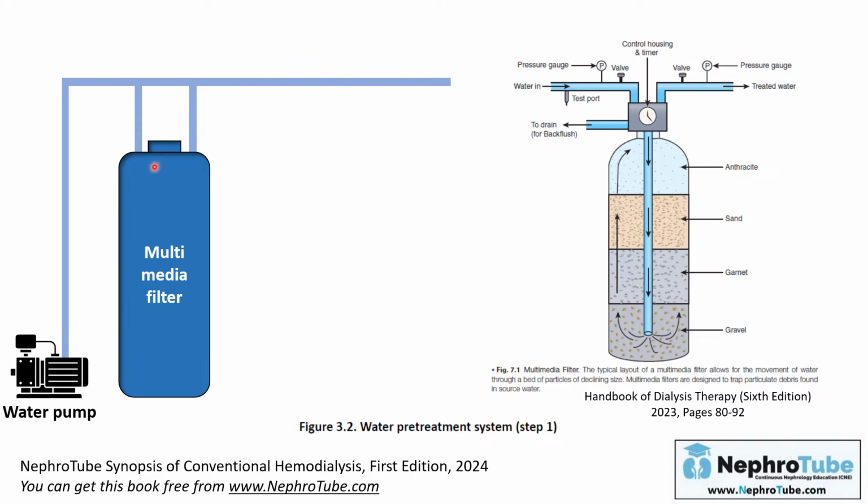And this is what I am showing here. You will find here a line, or port, where the water goes into the multimedia filter, and this is the line, or the port, where the water will come out to go to the next step.